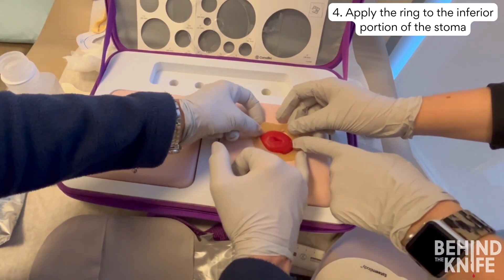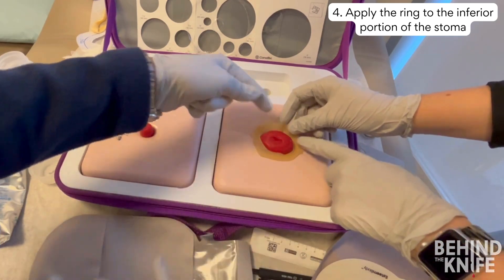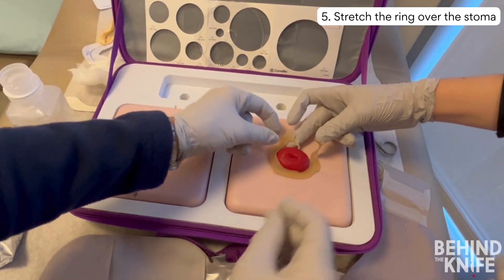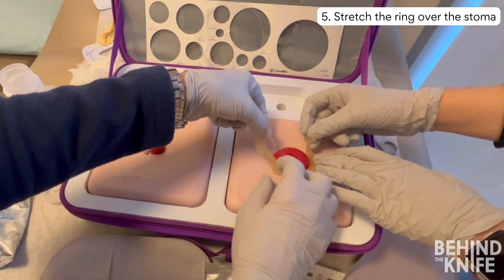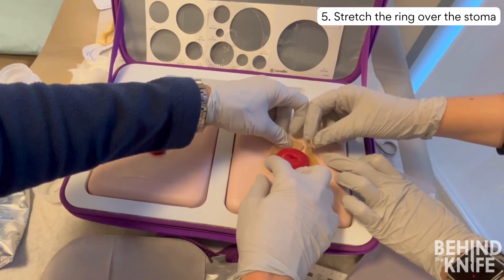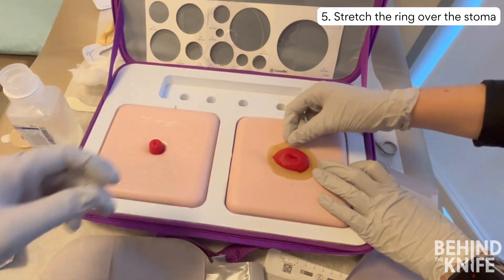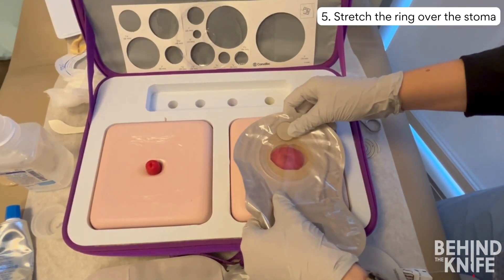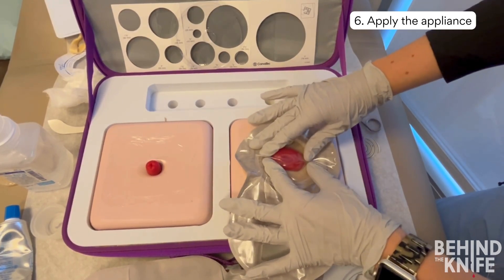Use one hand to hold the inferior portion of the ring in place as you stretch it over the stoma. If you over-stretch your ring, you will notice exposed skin at the top of the stoma. You can fix this by cutting your ring at 12 o'clock, then repositioning each side of the ring to hug the ostomy, covering any exposed skin and overlapping the pieces at the top. Once the ring is in place, apply the ostomy appliance as normal.